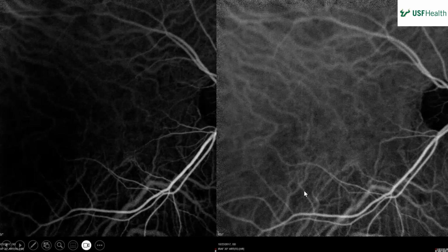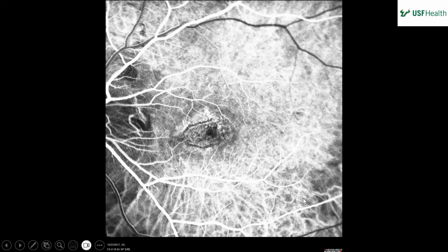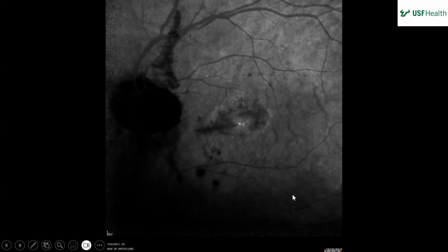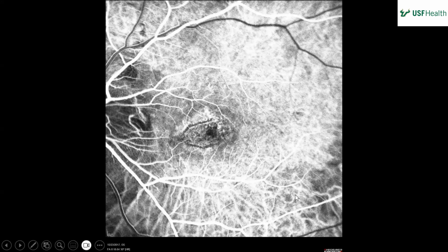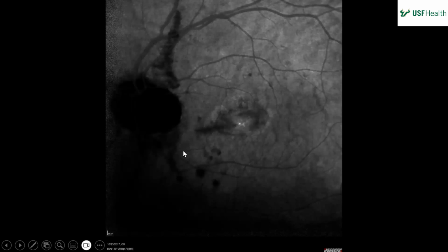Cool. And then I think I saw an ICG of the right eye. Looks normal, yeah. Okay, so we're kind of in the arterial phase and we're progressing through the laminar phase. And as we do that, you can kind of see, can you go back one? Just, and then forwards again, that one. There's like in the superior fovea area, right around that dark ring, there's like a little tuft of maybe some inappropriate vessels, like some NV. I was looking for branch vessels, and you don't really see them. I wish you'd saw more. You'd expect the whole thing to be sort of a nice vascular complex, but it's just not showing.